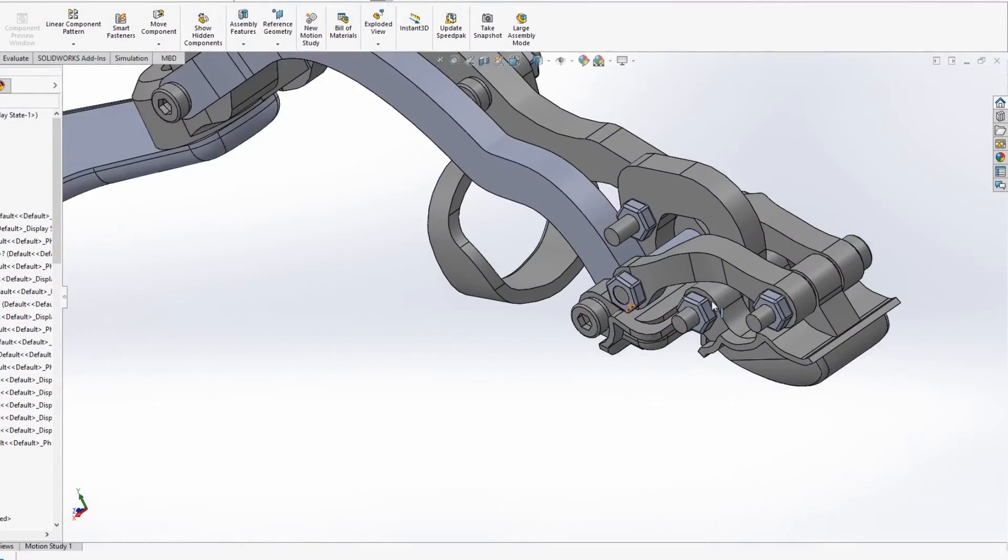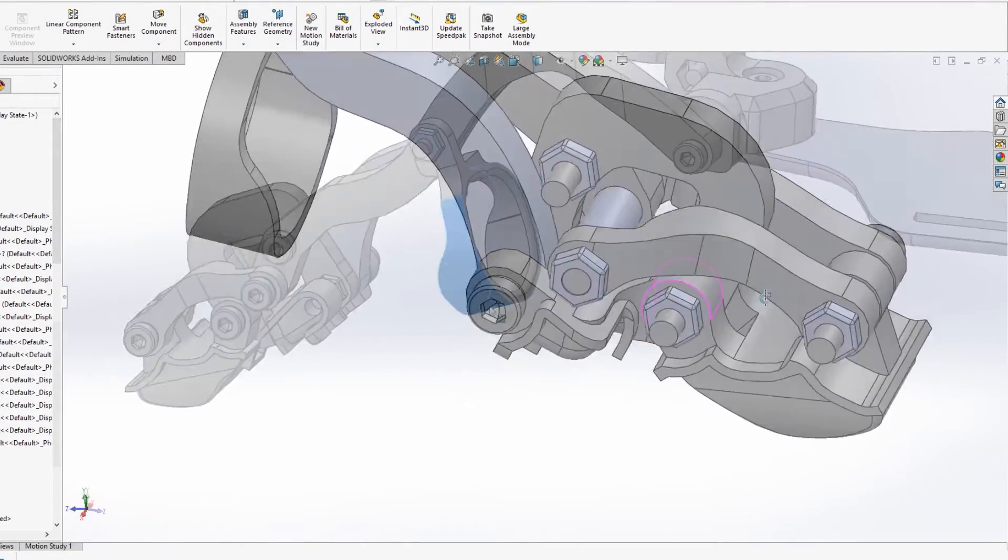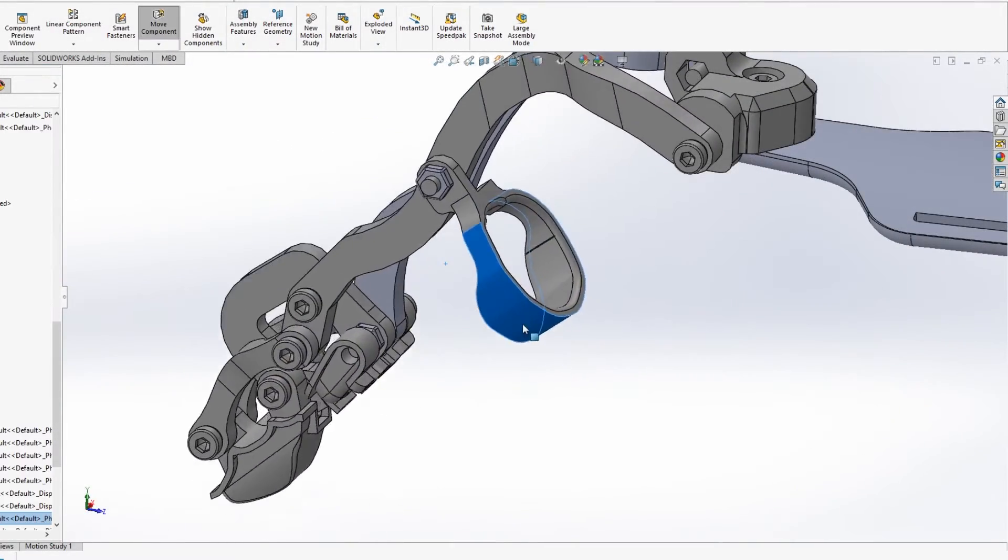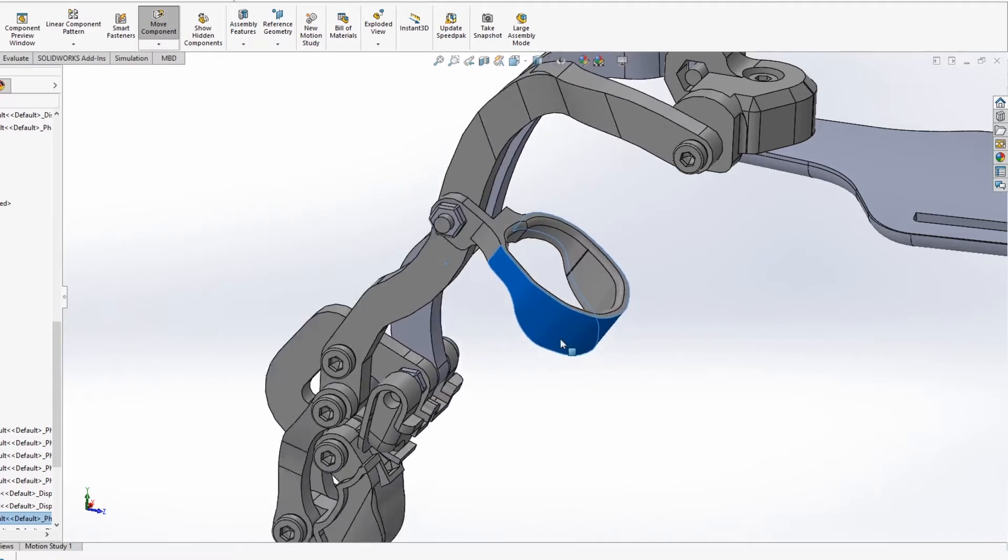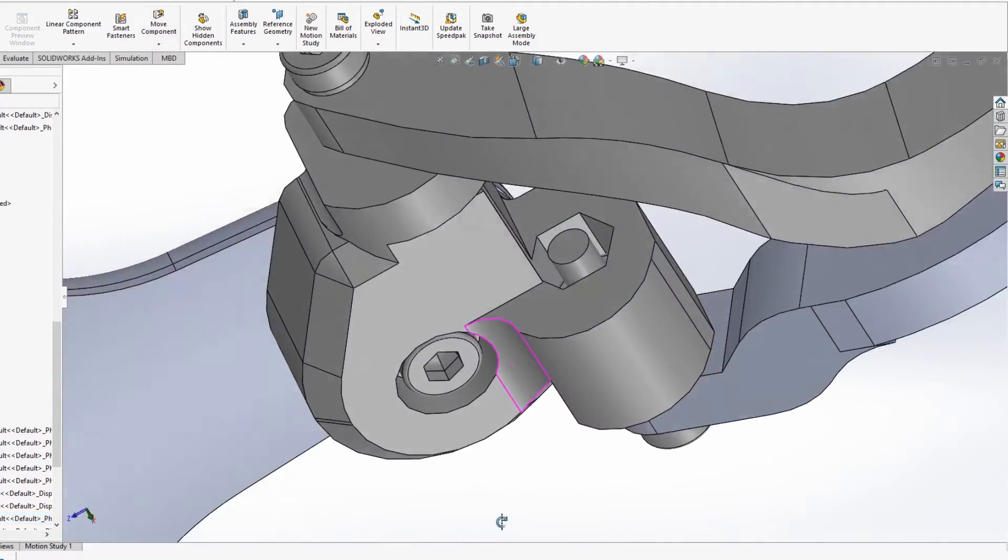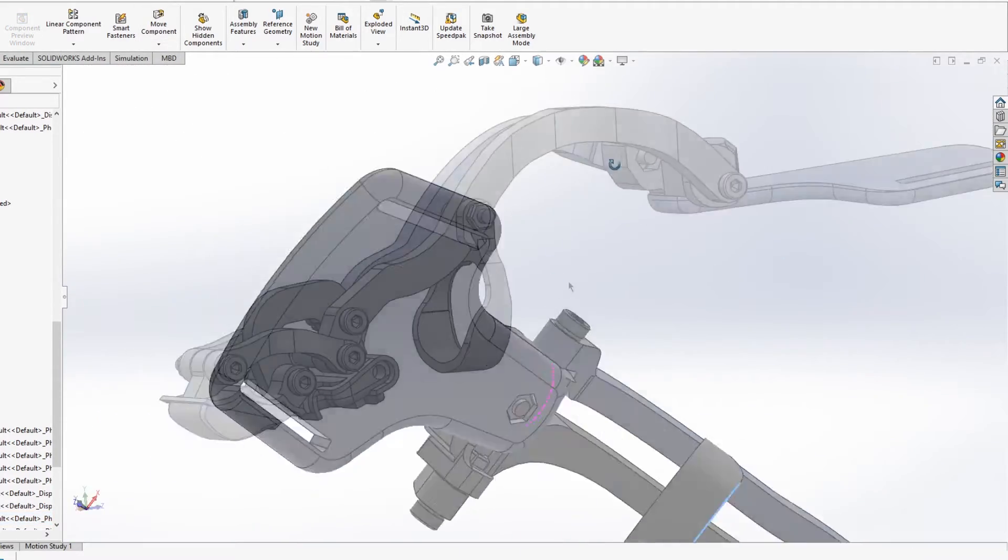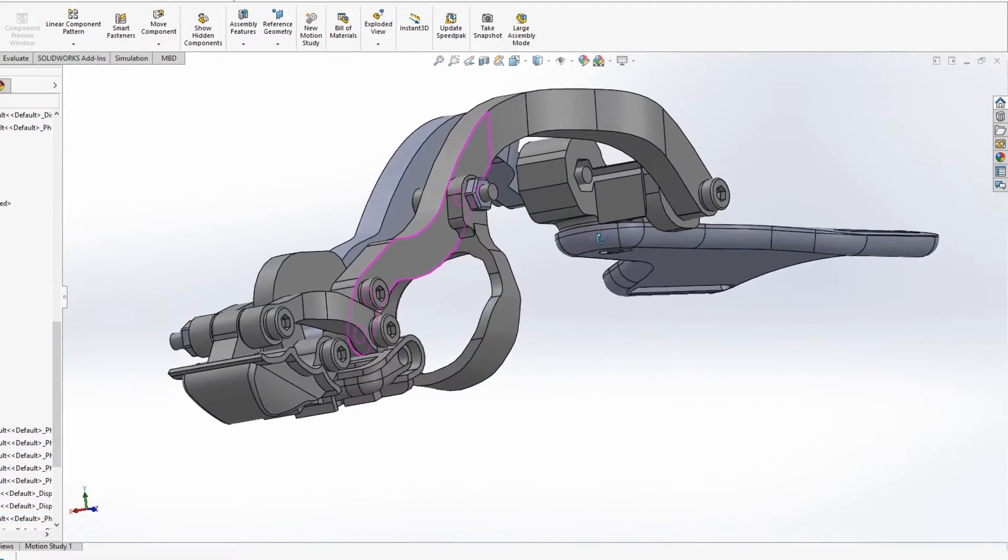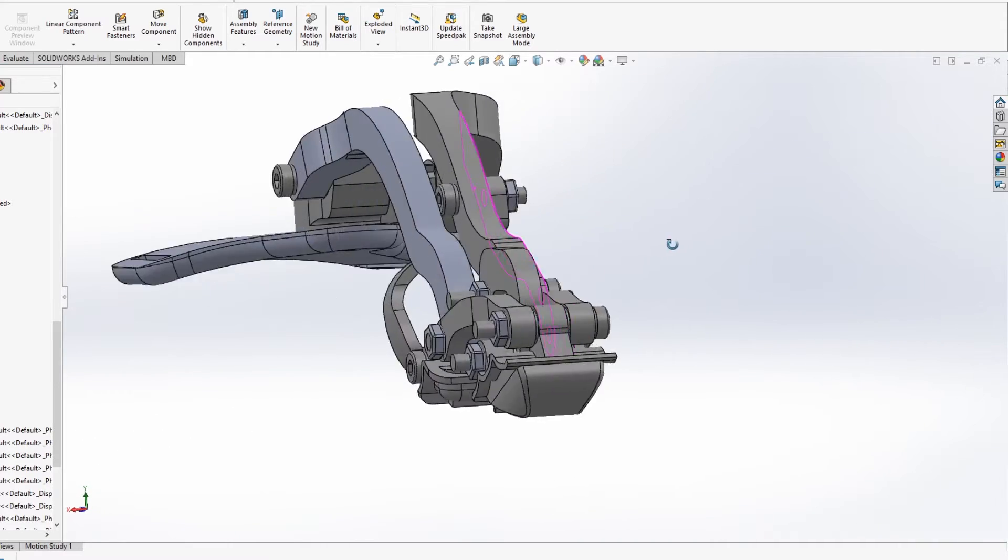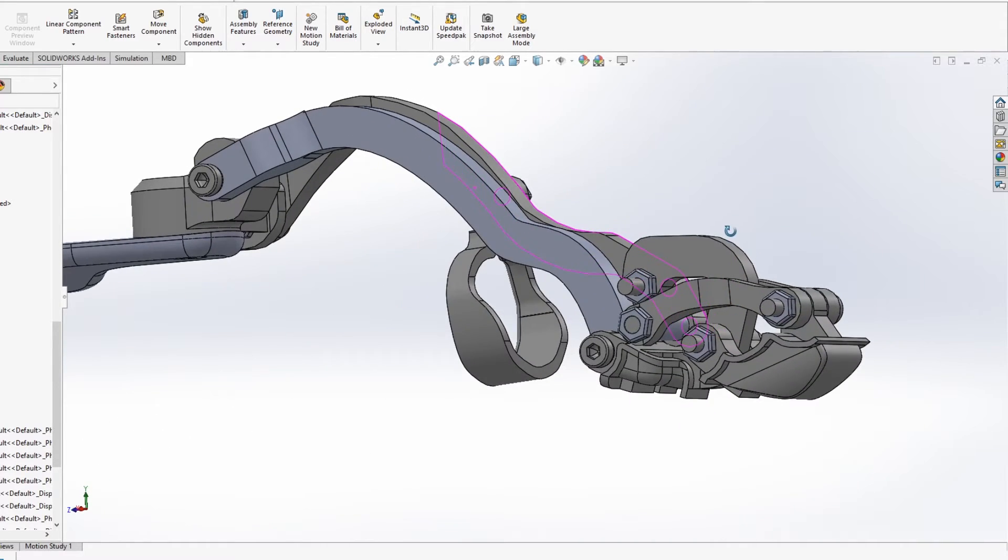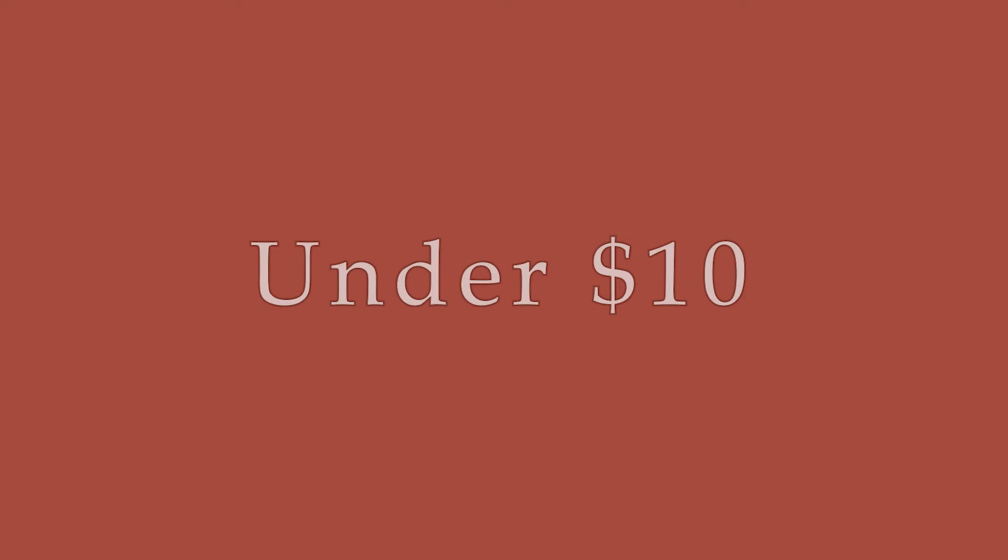The full design consists of 10 unique 3D printed parts and is held together only with M3 screws and nylock nuts. Other parts include the Velcro strap and a molded silicone interface used for the backplate and on the fingertips. The full cost of the materials is well under $10.